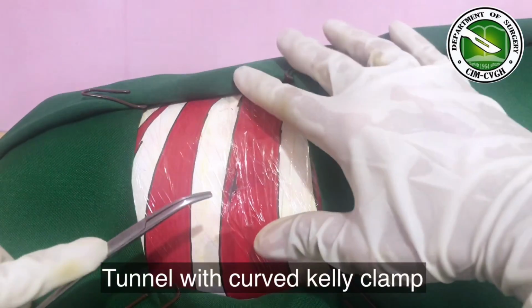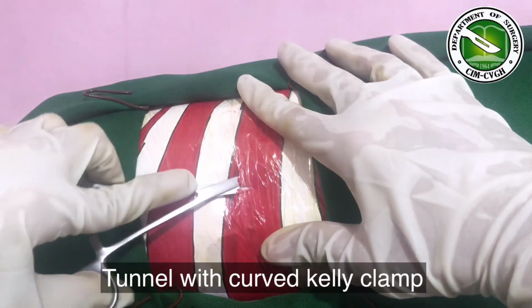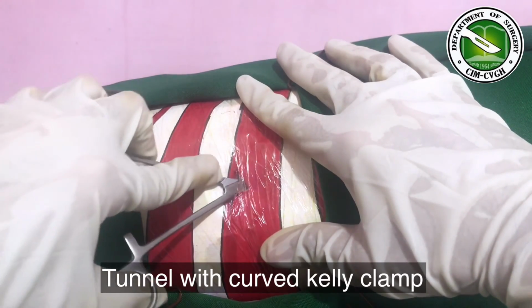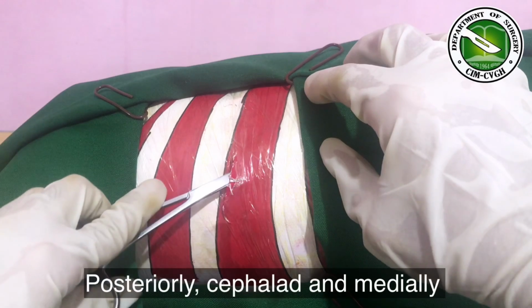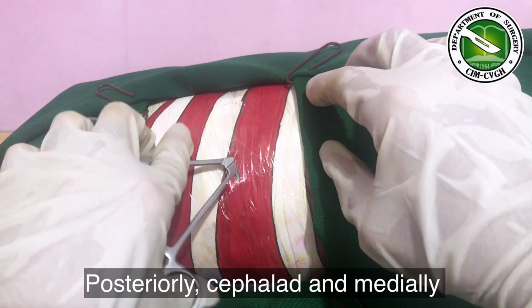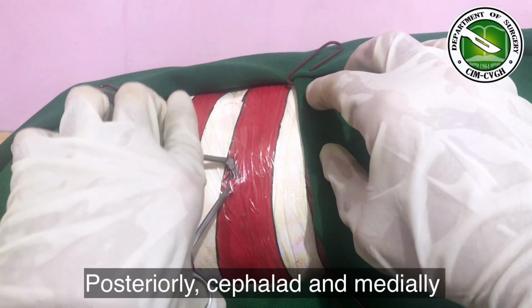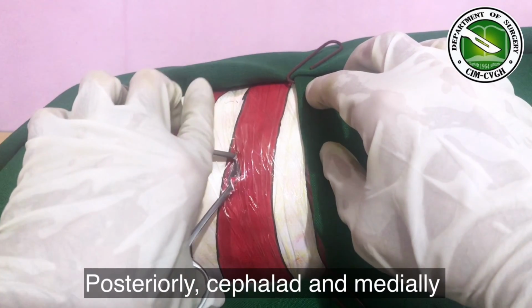Insert a curved Kelly clamp and separate the tissues so as to create a tunnel or track in the direction in which the tube is to be inserted. These tracks should be directed posteriorly, cephalad, and medially so that the tube lies posteriorly in the paravertebral gutter. Continue developing this track all the way into the pleura.